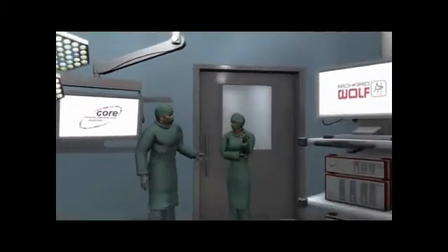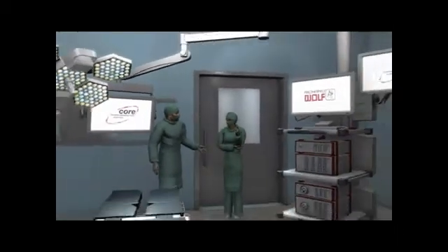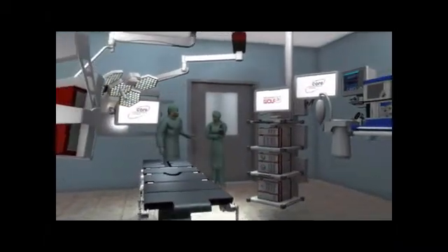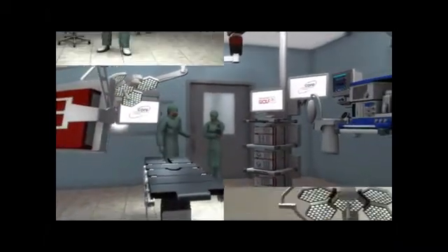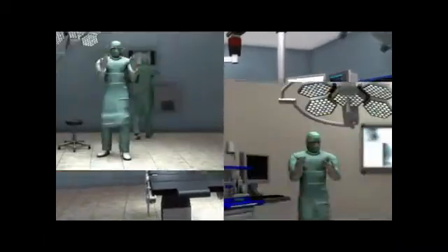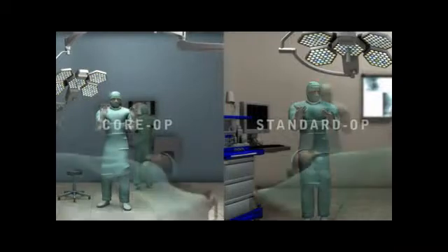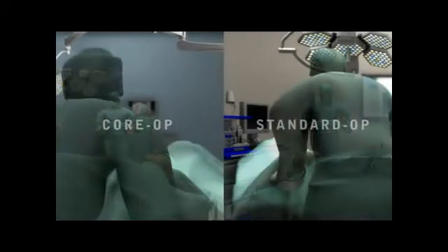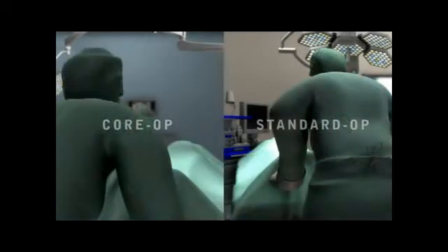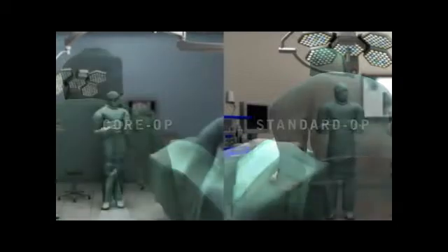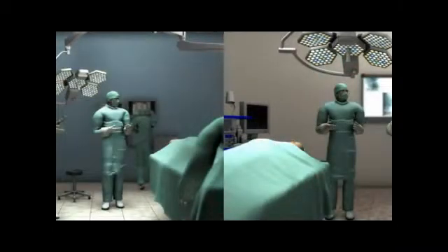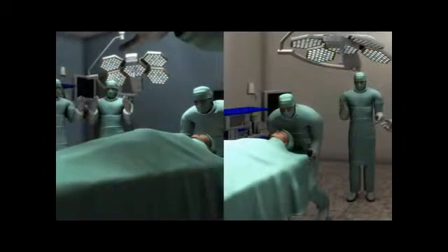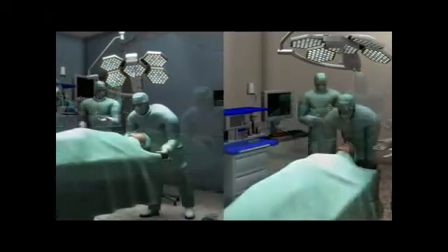What benefits does Core offer you in routine work? You can see that best by making a direct comparison. The same operation is beginning in these two operating theatres at the same time — a surgical operation. It's 9:30 and the anesthetized patient is already on the operating table.